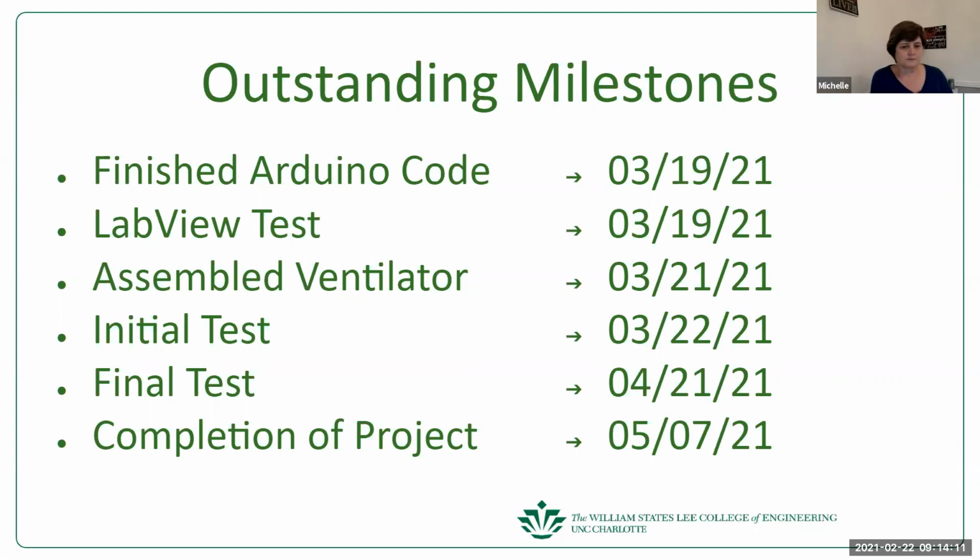Okay. Yeah, it would be nice to know, when you present the final report at the expo, how did you prove that it worked? How many breathing cycles does it take to show that the pressure stabilization is there, the temperature, humidity, that you can change the dials and that they respond quickly enough or whatever?